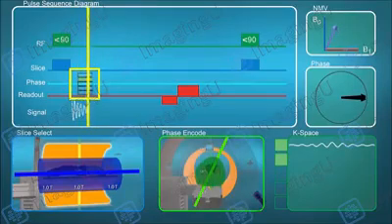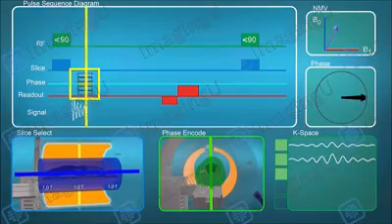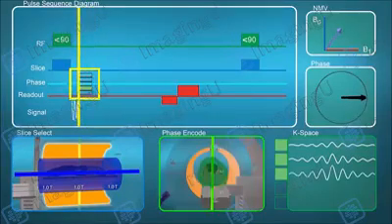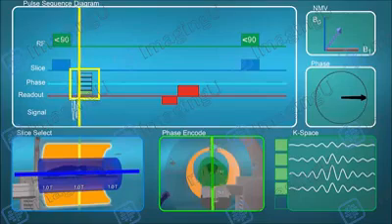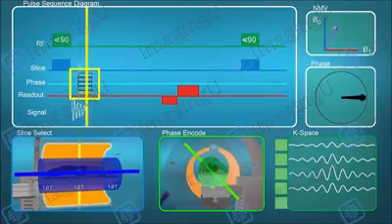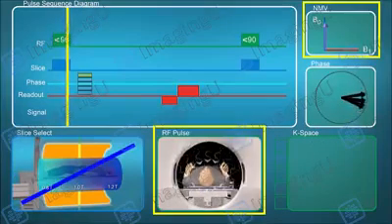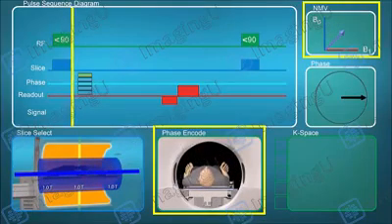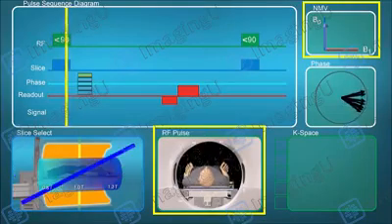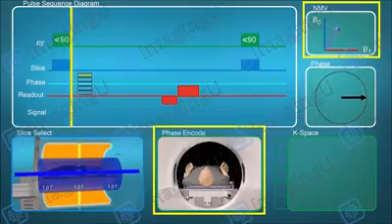So, the only thing we are changing within a pulse sequence each time we are acquiring data within a given slice is the phase encoding gradient. Radio frequency bandwidth, slice, and frequency encoding gradients all stay the same. The RF excitation pulse will deliver energy to the patient and cause the flipping of the net magnetization vector. We can only record the component of the net magnetization vector in the transverse plane, B1.